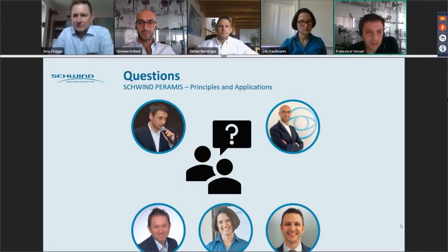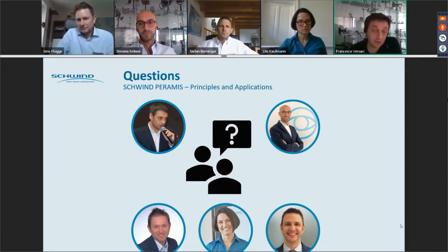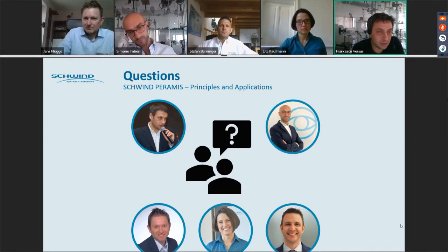I fully agree with Simone's answer about the angle kappa, because the angle kappa is nothing but the big decentering of the pupil center respect to the corneal vertex, but this doesn't impact that much on the quality of the acquisition. It can impact the quality of the export, because if the pupil is strongly decentered, you might have more issues reaching the minimal diameter for the export, but it doesn't impact the quality of the keratoscopy itself.